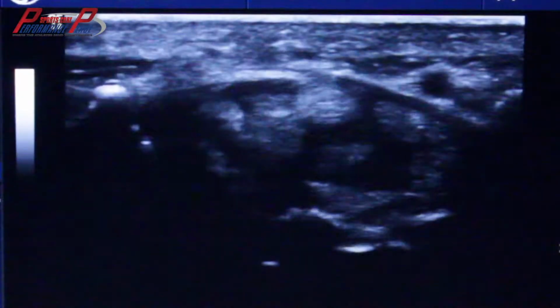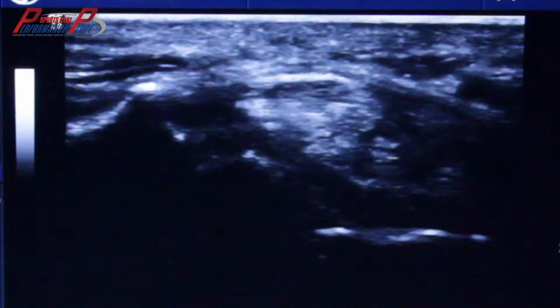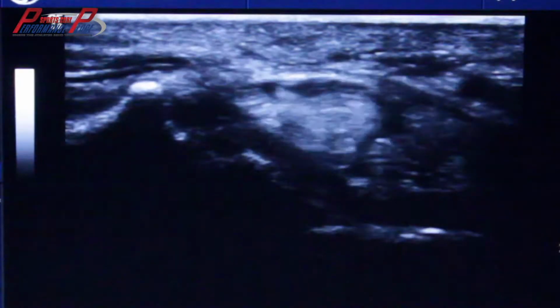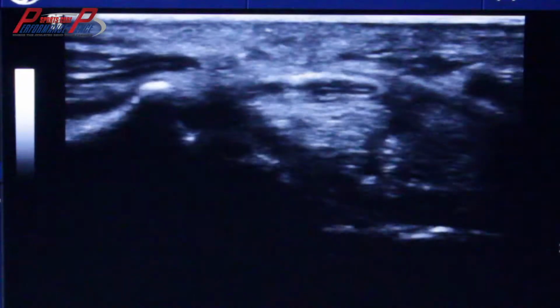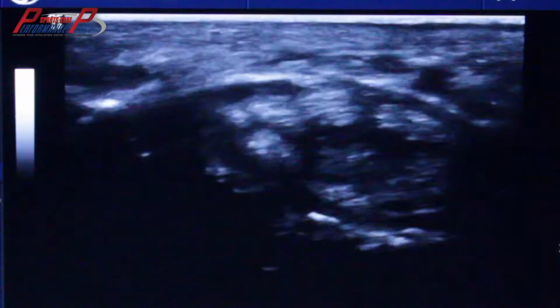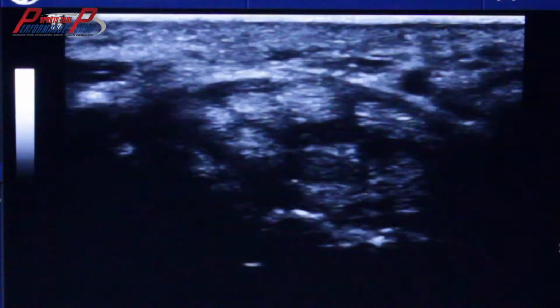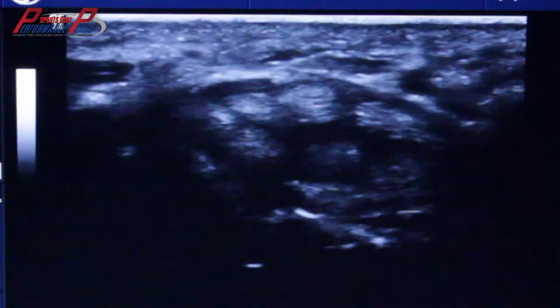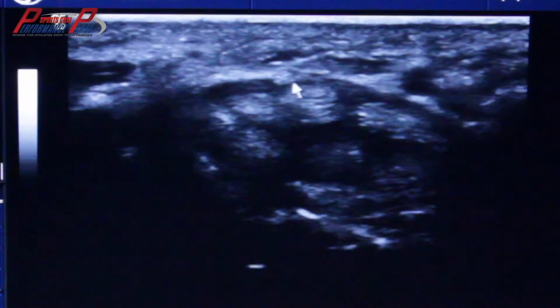Now, first off is we have to be able to identify a nerve. So right now I'm wiggling my fingers, and this is actually a cross-sectional view, which is kind of slicing all the parts in half at the actual carpal tunnel right there. You see at the top there's the transverse carpal ligament, which is, I'll pause it, and we'll roll back. Let's get a pointer. So this is the transverse carpal ligament right here.